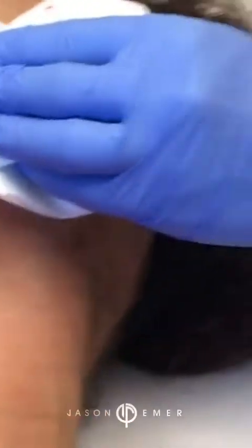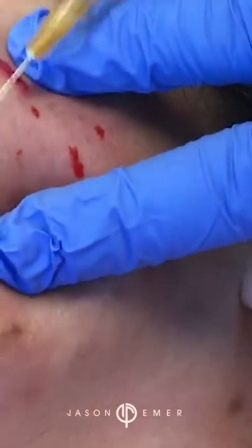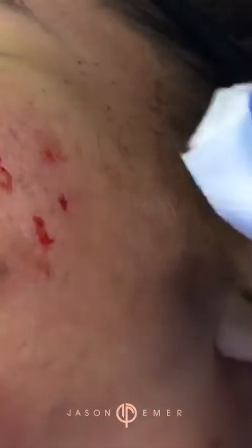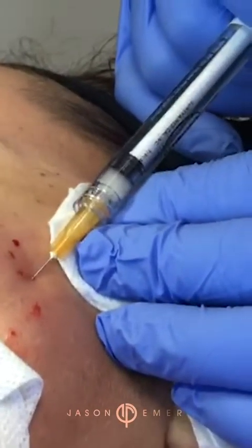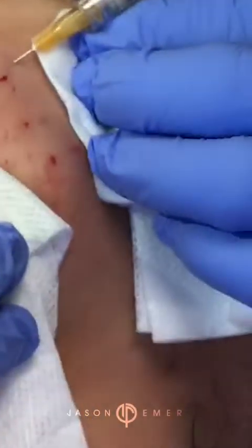When scars come together when you smile, it means they need volume. So we're looking to see, when she's smiling, where the scars are coming together. Smile again. You can see right in this crease right here, these little scars come nicely together. So we're going to put a little bit in there. Same thing right here, just a little bit right there. Good. Smile again. Great. It's hard to smile when you're getting poked 1,000 times, but I get it. I'm trying to be very precise.